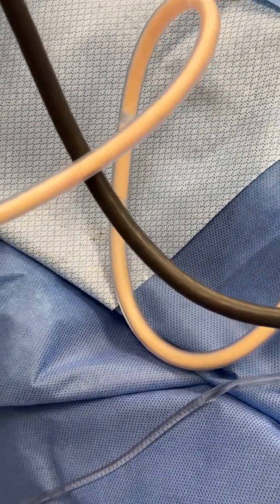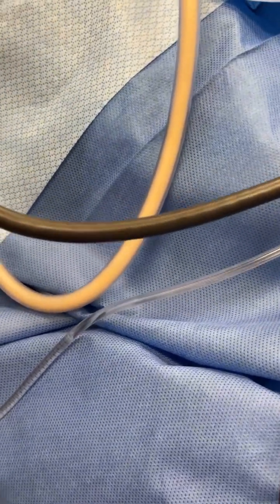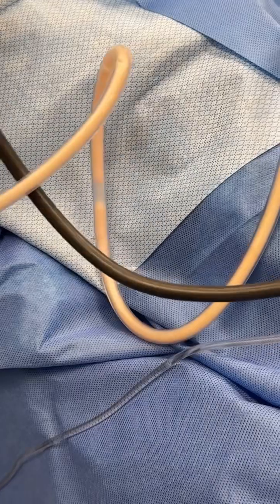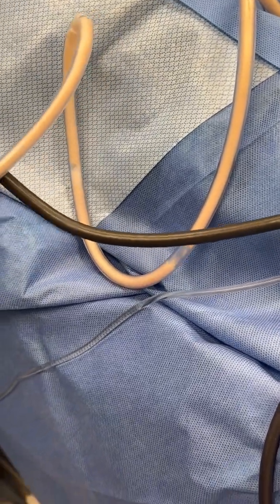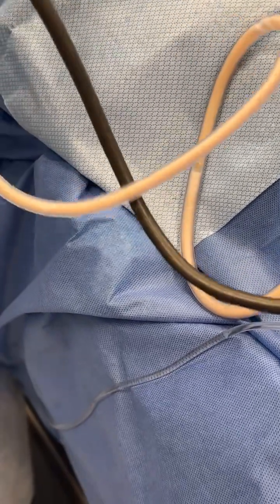Yellow fat in there. Yellow, beautiful fat, but we waited over an hour before we started. The patient is instructed not to take any aspirin-like medications, no heparin, no ibuprofen, no herbs. The surgeon does not use any heparin or enoxaparin or aspirin or any medications that would cause bleeding, right? And that's how you can obtain this incredible aspirate.